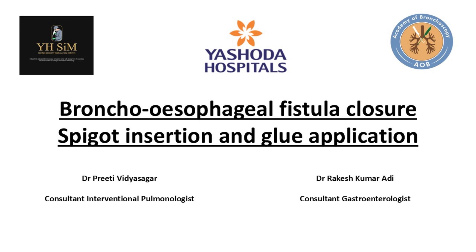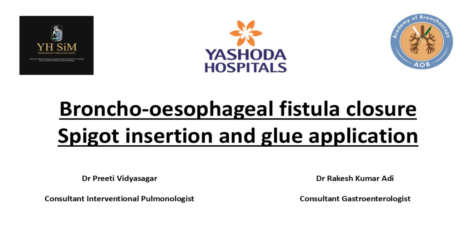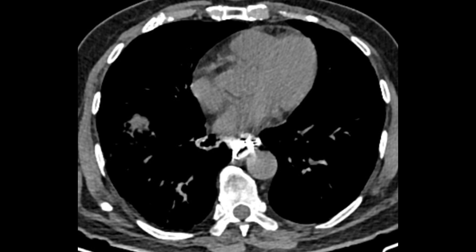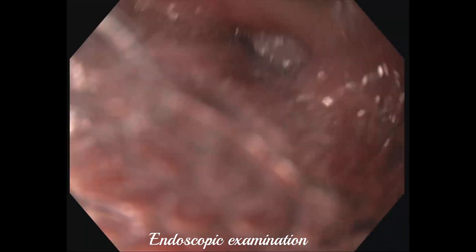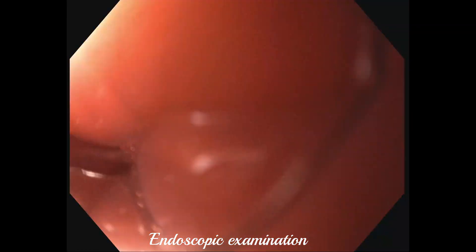From the Division of Interventional Pulmonology, Yashoda Hospitals, Hyderabad. We present a case of an 80-year-old male with a history of pulmonary TB in 2022.